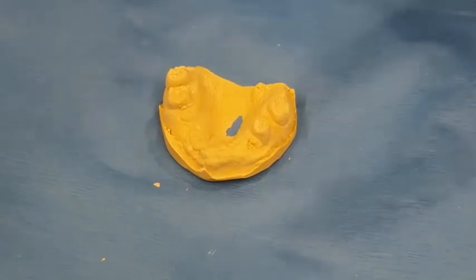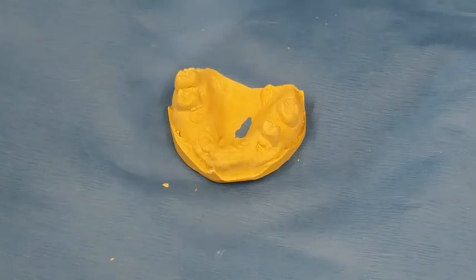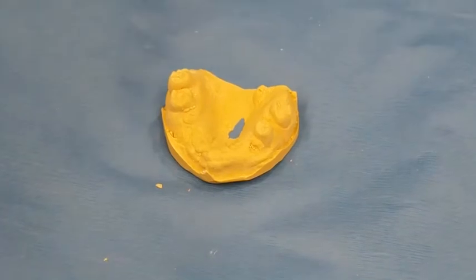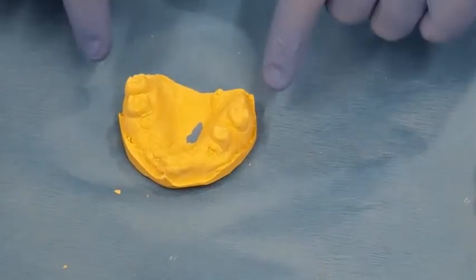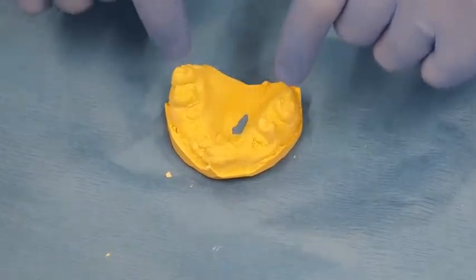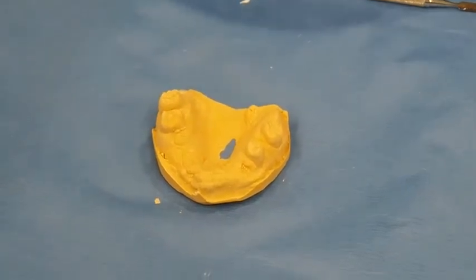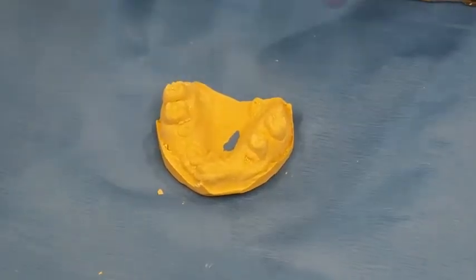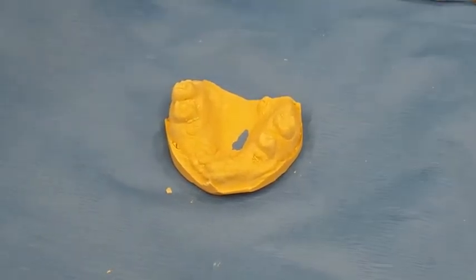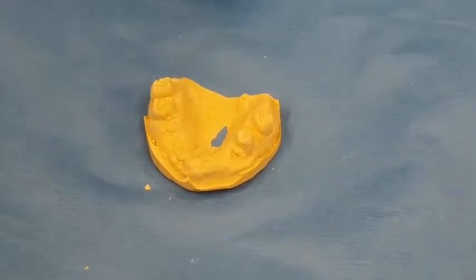Well, one of the options is to fabricate a custom impression tray. This would be the precise case, or a very good case, for an immediate denture. An immediate denture means that at the time we perform the extractions of these remaining teeth, I will be delivering a complete denture, okay? So that means I have to have that denture finished, processed, and ready to be delivered prior to the extractions of the teeth. So what am I going to do?